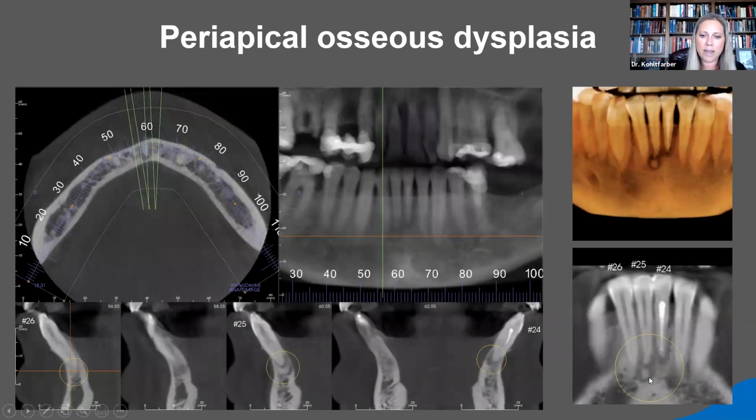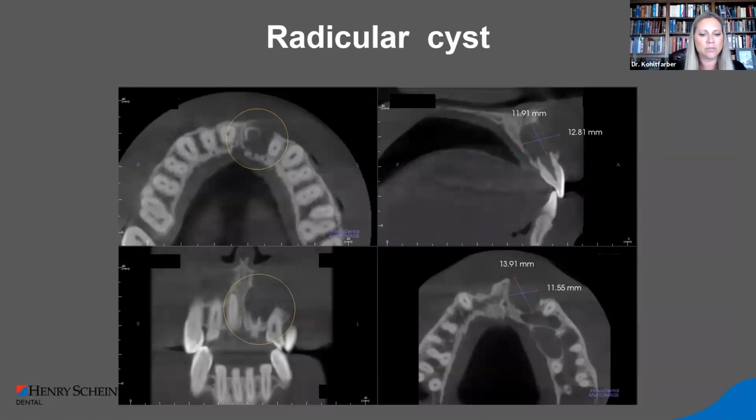And of course, we can have periapical cemento-osseous dysplasia, or fibro-osseous lesions, that can look like apical lesions. It's why we should always vitality test these teeth. We can see root canal treatment's already been performed on this tooth, and unfortunately, it's just because of a fibro-osseous entity. The patient probably didn't need to have root canal treatment. So again, really good reason for CBCT.